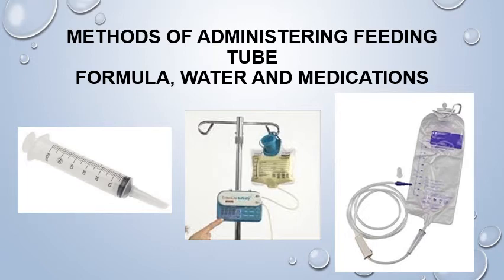The process of administering supplement, medications, and water for hydration is always the same. Water, medications, water, supplement, final doctor-ordered water flush. For only supplement administration: water, supplement, water, and the same for only medications. The amounts of water will vary for each person, but the process will be the same. Take exactly what you need with you. When everything has been instilled in the tube, you are finished with the task.